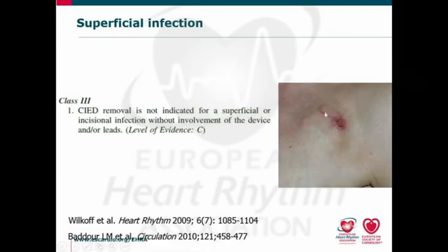In this instance, the patient had the wound which was cleaned up and put on systemic and local antibiotics, and actually evolved favorably and had no problem thereafter. But you have to keep a close watch.